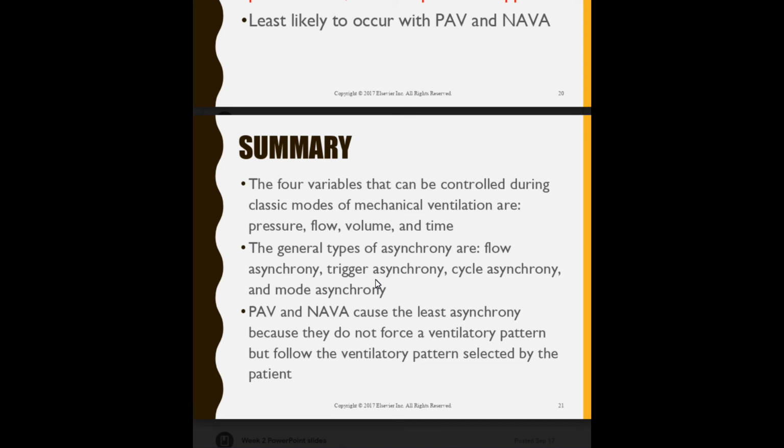Again, sometimes it's the ventilator, and so we have to continuously make sure that the ventilators are getting their periodic maintenance. And when you move on in the field to become directors, that's what you'll deal with. You'll deal with what we call PMs, or periodic maintenance. You want to maintain those ventilators. They're getting cleaned up. They're getting their diagnostics checked.